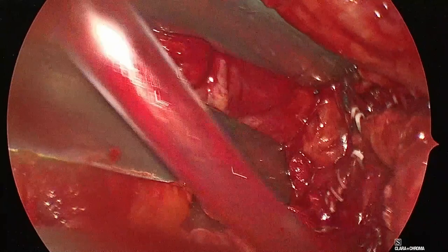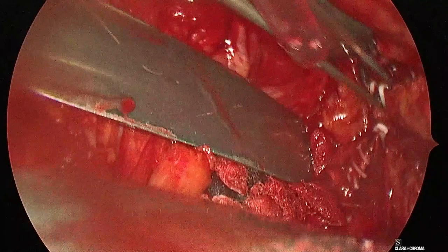And ligature or end seal, whatever it is. So now we need to take care of this.